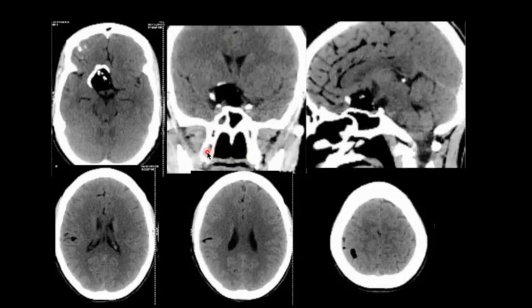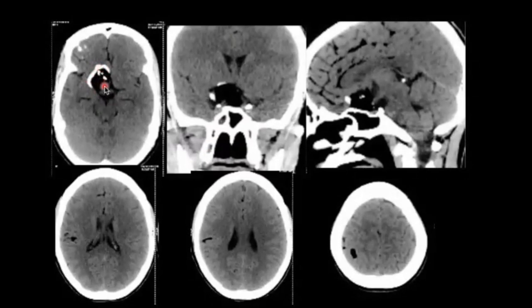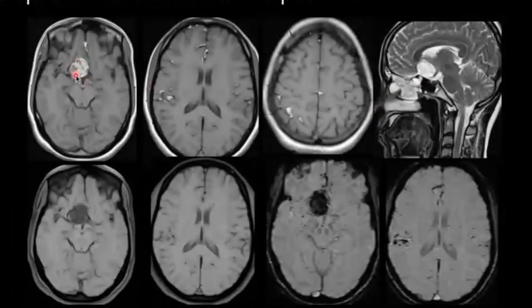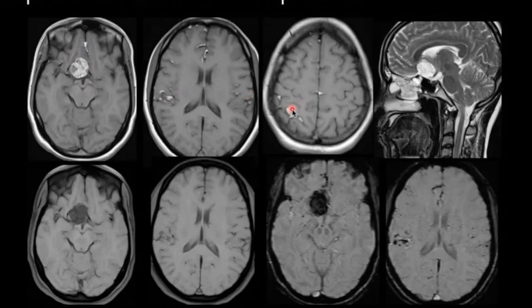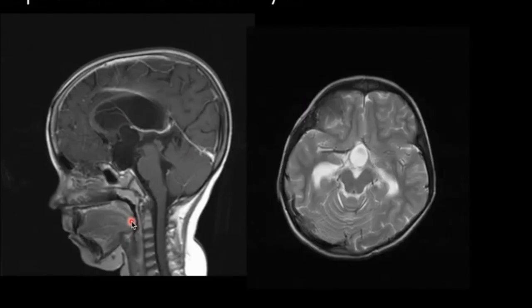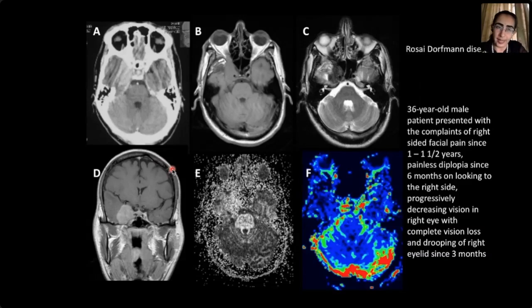Here is another suprasellar meningioma with the adenohypophysis separate and a classic dural tail sign. Another patient on CT shows a fat-intensity suprasellar lesion with calcification — this is a suprasellar dermoid. On pre-contrast images it is hyperintense with hyperintensities along the sulci, indicating the dermoid is ruptured. Tiny suprasellar fat-intensity lesions on non-contrast T1 coronal images could represent a lipoma or a tiny dermoid. A CSF-intensity suprasellar lesion with no enhancement is a suprasellar arachnoid cyst.